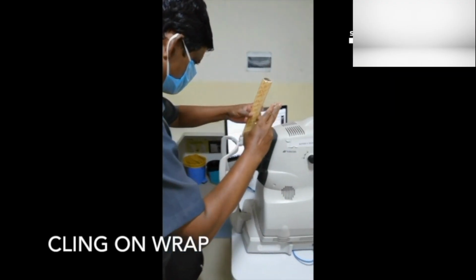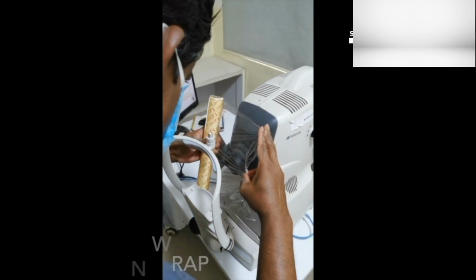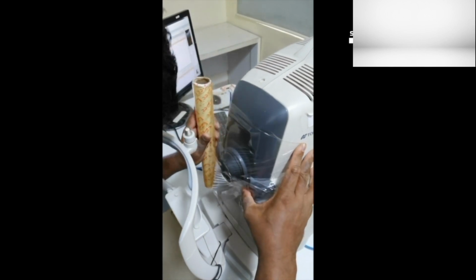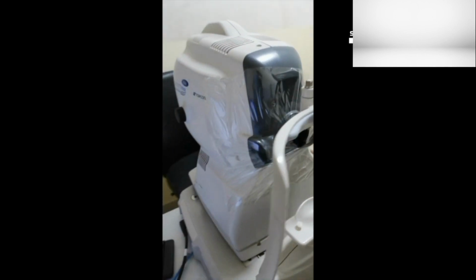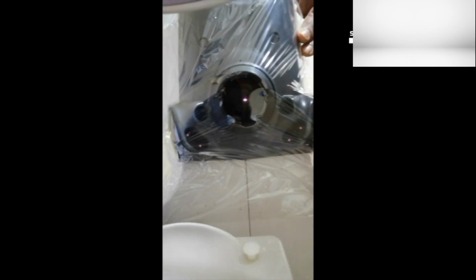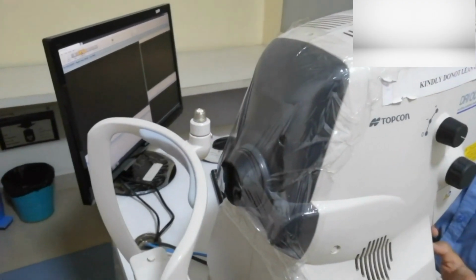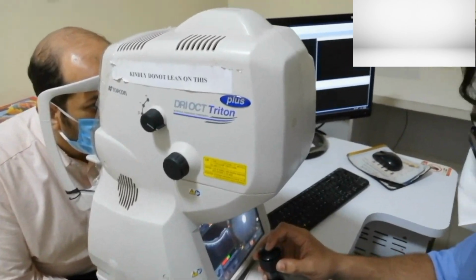Take an adequate length of the cling wrap to cover the front surface, including the lens and the sensors of the machine, attaching it to the side walls. The entire process of covering hardly takes 5 minutes to complete. Make sure that there are no folds in front of the lens. The covering can be easily cleaned between patients and changed at the end of the day.